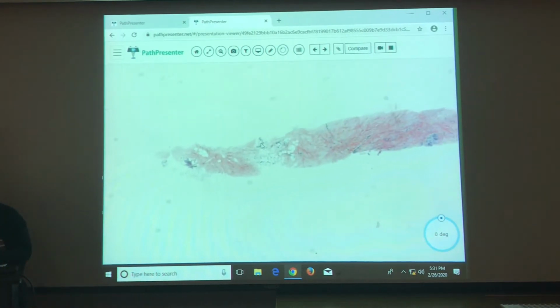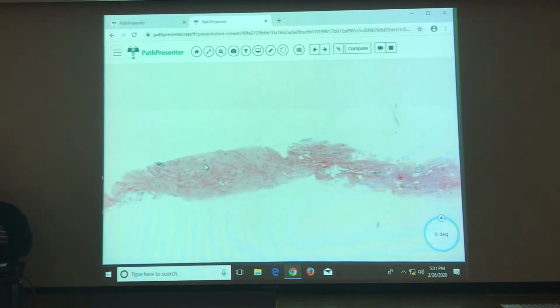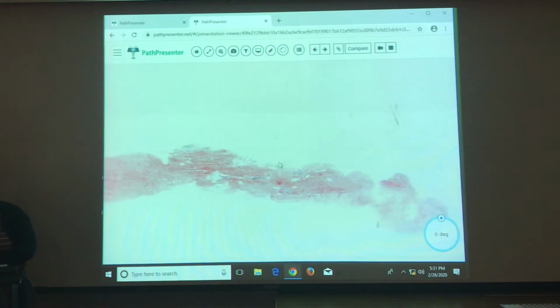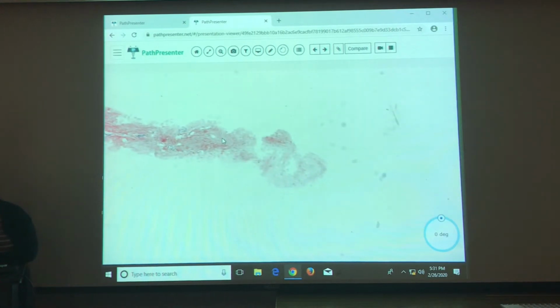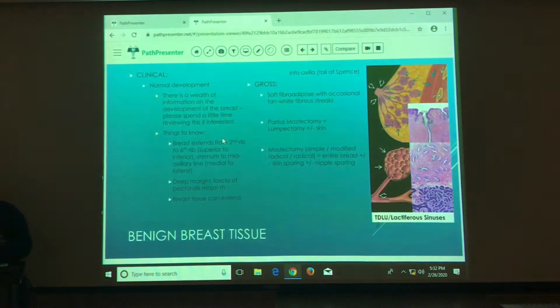Okay. I didn't think fibrotic breast. Yeah, very dense breast, right? Sorry, I wasn't trying to stump you guys with the first one. I guess I don't give you normal too often.